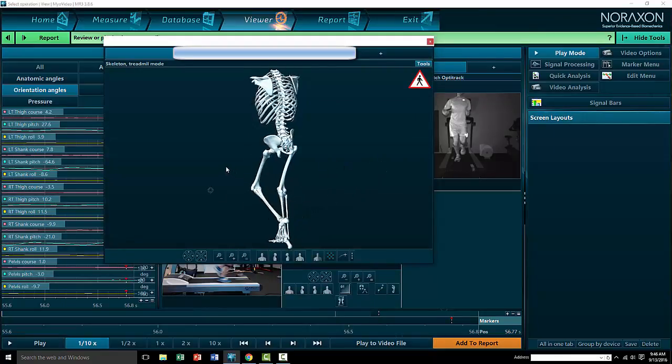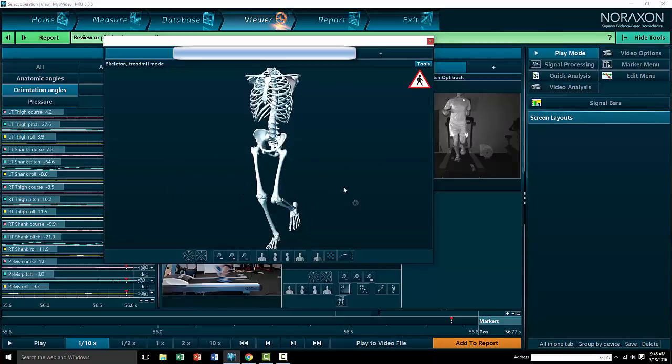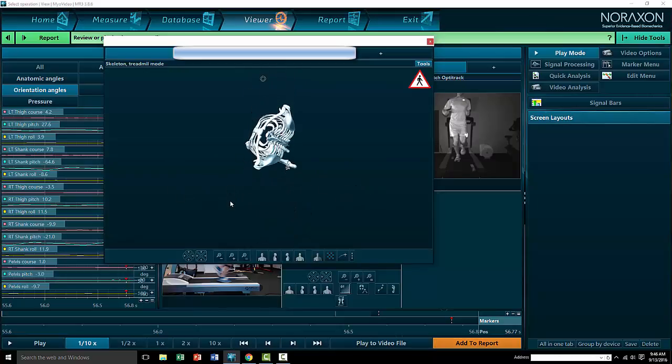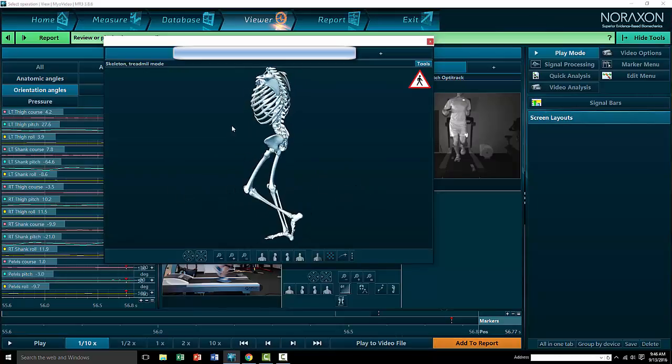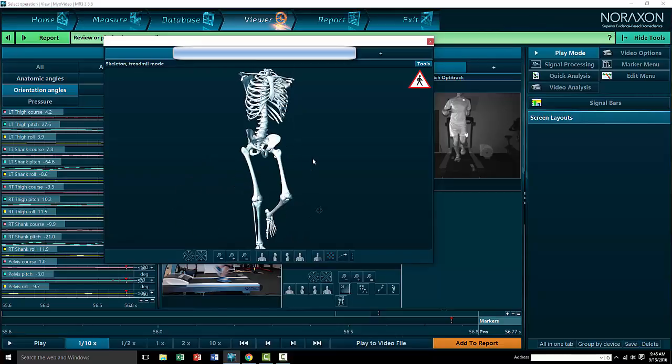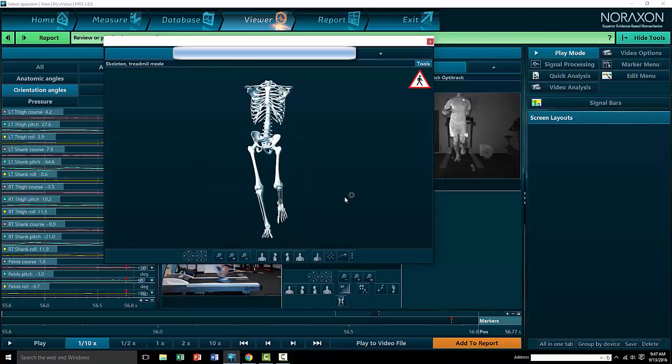With this system, we can look at any angle we want: posterior, anterior, side view. We can look from the top. This gives us unprecedented access to be able to see the body in ways you just can't capture with an iPad or an iPhone.